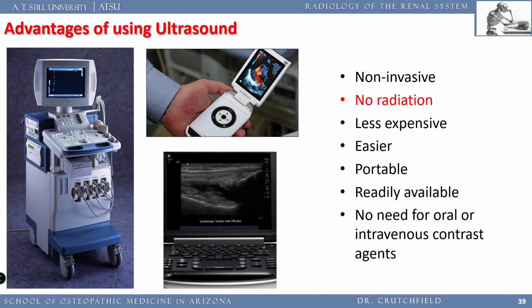Okay. So advantages of using ultrasound, probably here, it's relatively inexpensive. It's quick. Most hospitals run ultrasound departments up until midnight. Sometimes they'll even call ultrasound techs in at night to do ultrasounds of the kidneys. There's no radiation. They're portable. This is a machine that I had in my office. It was a Toshiba machine. I had all the bells and whistles, but I sold that puppy. Great machine. But anyways, it's really no radiation. It's quick. It's easy. It's relatively inexpensive, and there is no need for contrast agents.